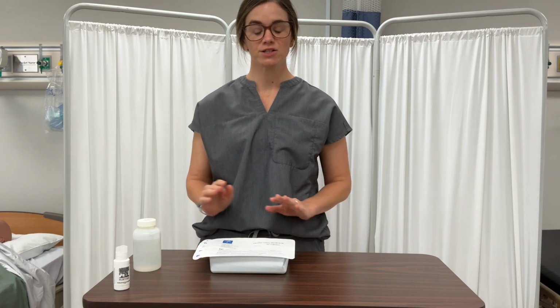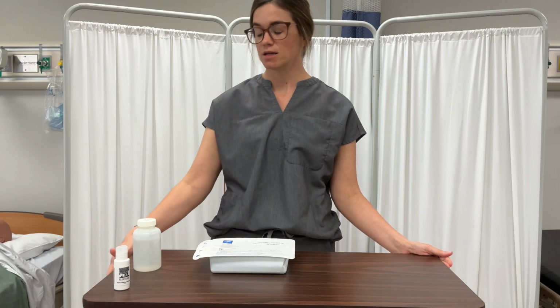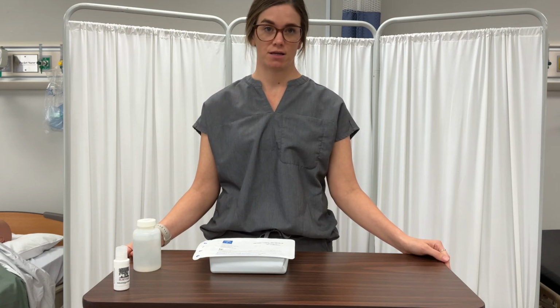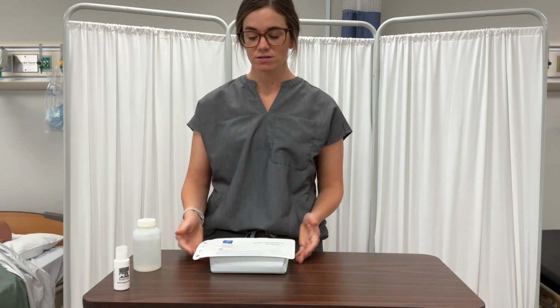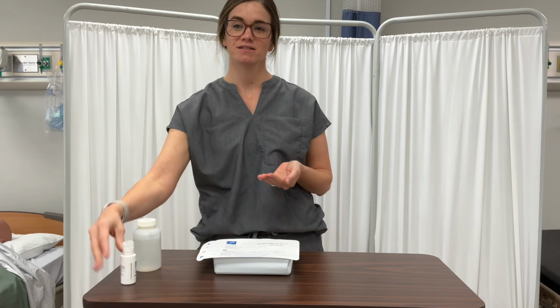Before I start, I'm going to make sure that my area works for me, make sure my bedside table is a good working height, and that my trash receptacle is somewhere where I can access it easily. All right, so the first thing I'm going to do is wash my hands.